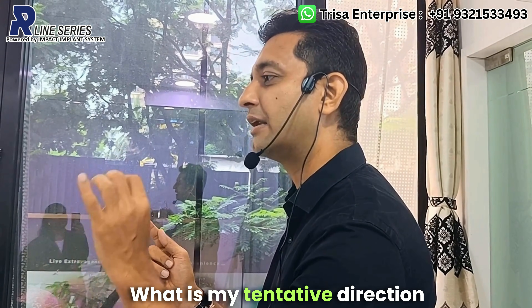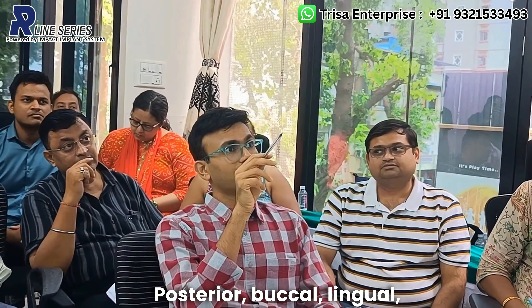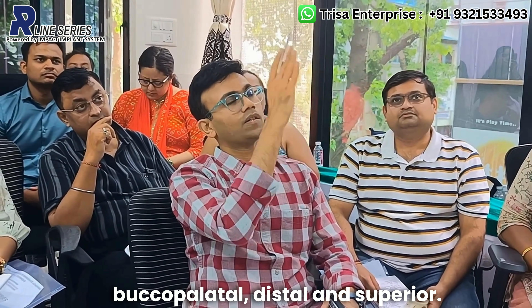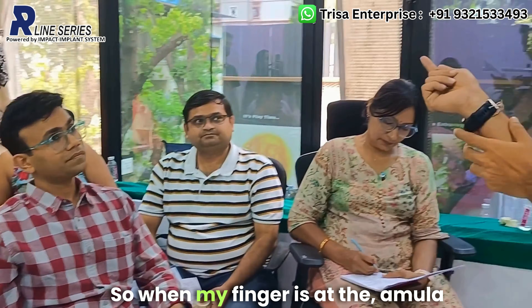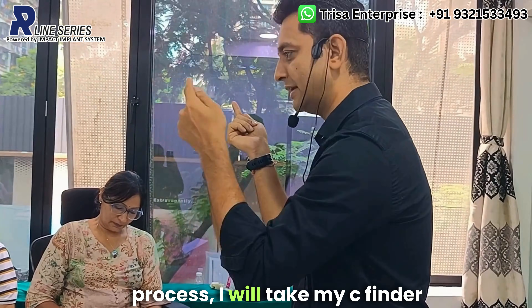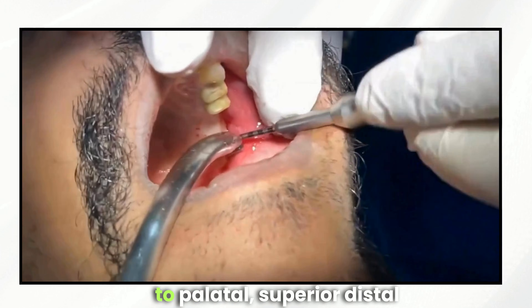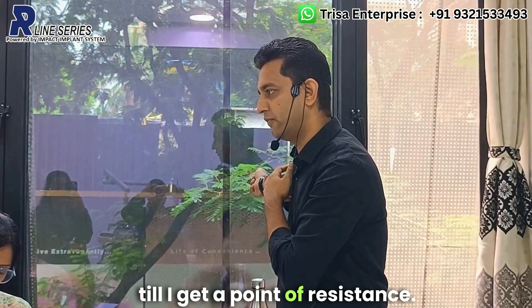With your finger at the hamular process, the tentative direction for placing the C finder is posterior, buccolingual, buccopalatal, distal, and superior. You will take the C finder and insert it buccopalatal, superior, and distal until you get a point of resistance.